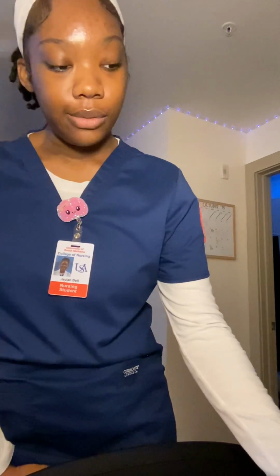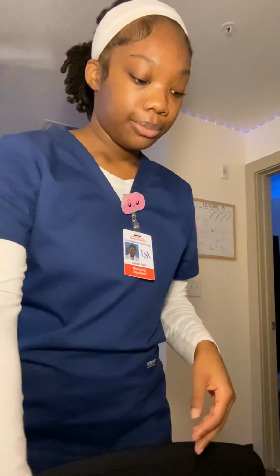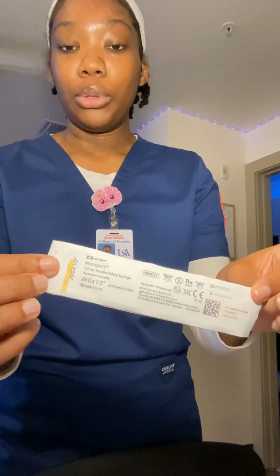And I do have the right syringe and needle for that, and this is a 1/2 ml insulin syringe. For the right dose, we'll be giving Mr. Jones 10 units of insulin, and I know this because the vial of insulin, again the correct medication, is measured in 100 units per milliliter, and the correct syringe and needle is measured in 50 units per 1/2 milliliter. So when doing calculations, I would still draw back 10 units in that specific syringe. And also when doing calculations, you want to check with another nurse if indicated.